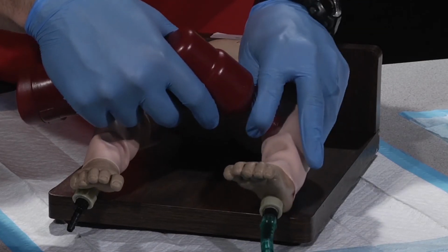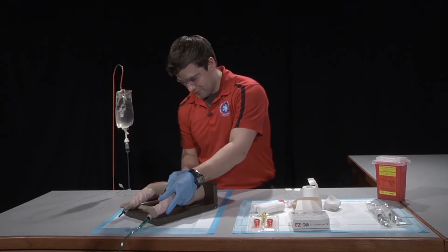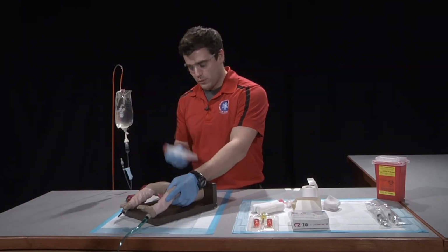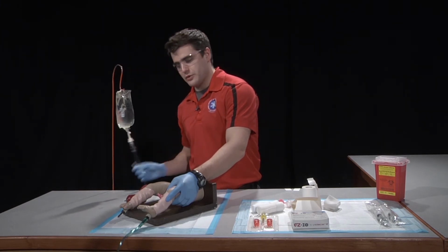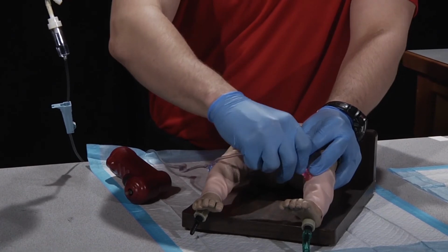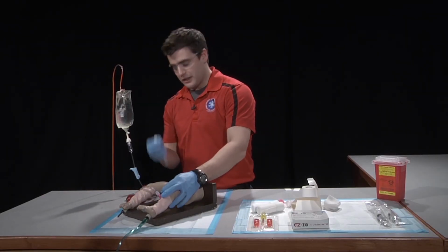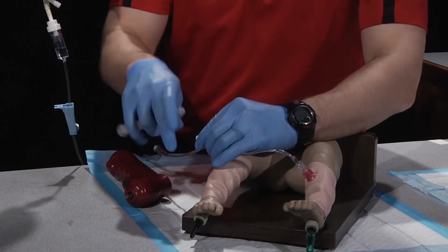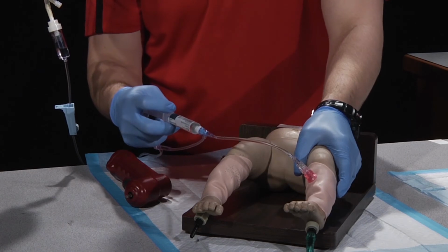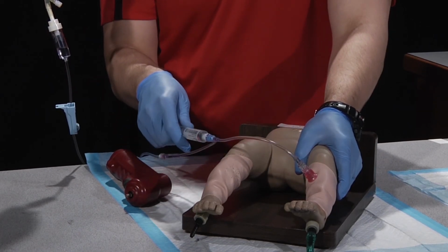From there, we will remove the insertion device, remove the needle from the catheter, and sharps the needle. After we've sharped the needle, we're going to attach the administration set to the line. From there, we'll attach a saline flush to the port and slowly inject while assessing for infiltration and aspirating to make sure that we have a patent line.